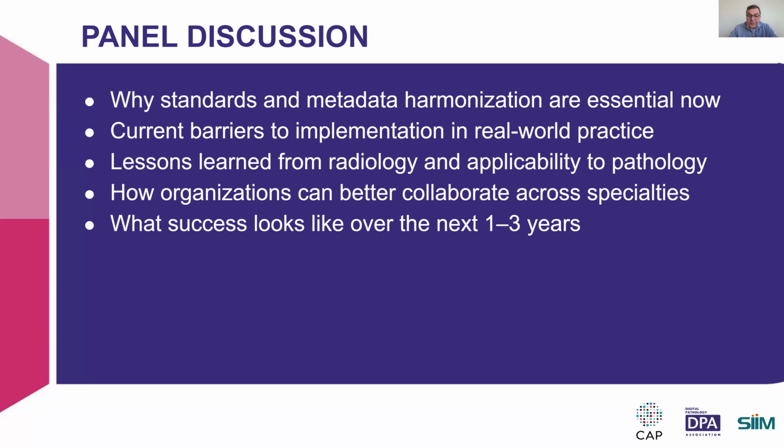There is also no consistent procurement requirement. Hospitals and health systems are not asking about DICOM conformance statements when purchasing or when requesting an RFP. And that's the problem. A conformance statement without validation is just a standard on paper.